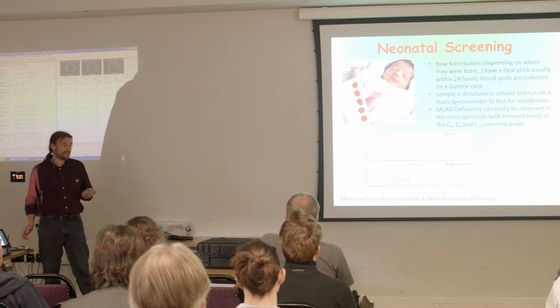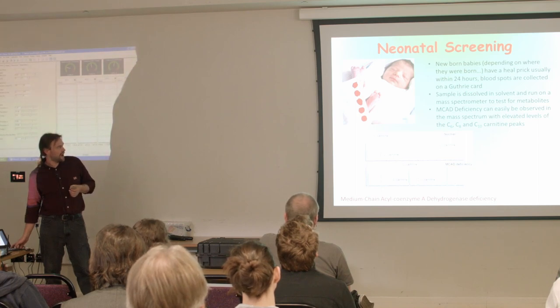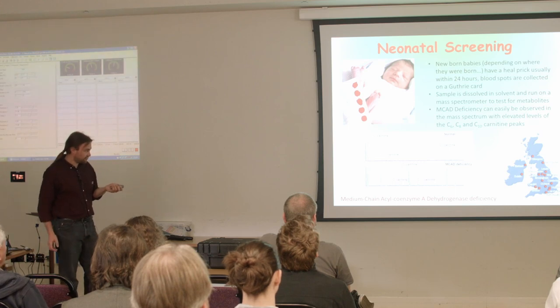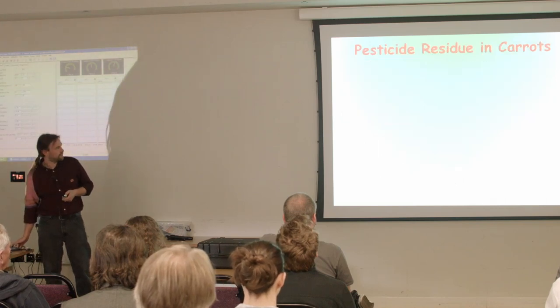So we're very lucky in this country. All of our children are screened. In America, they're all screened if you pay your medical insurance. A lot of countries in the world, they're not screened. So this is all the neonatal screening centres in the country, and they all use Waters mass spectrometers as well.